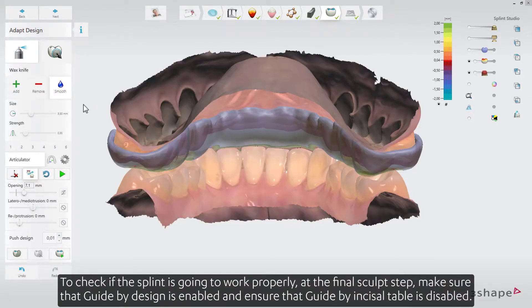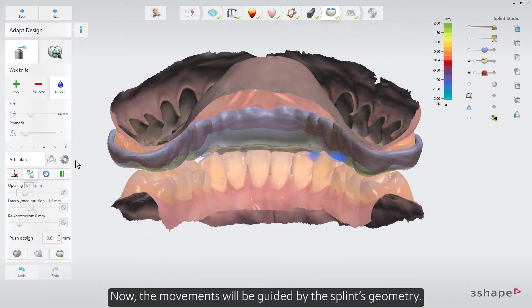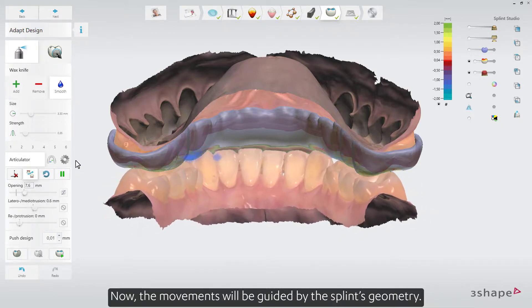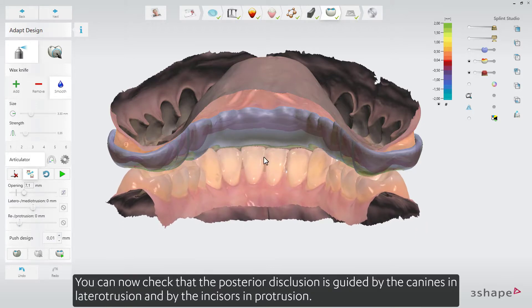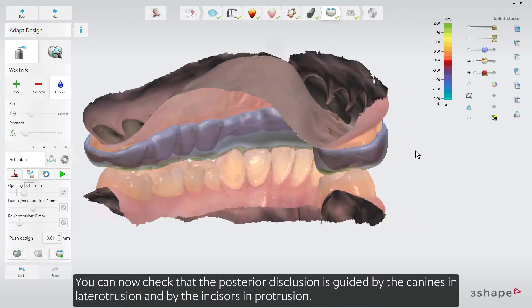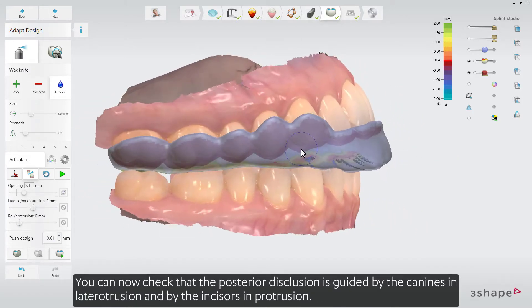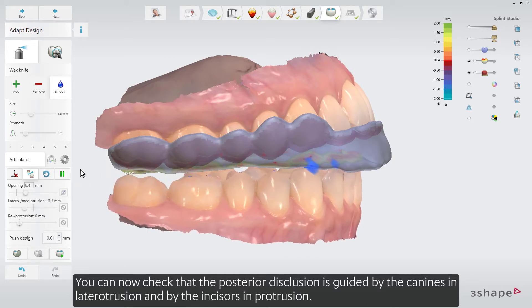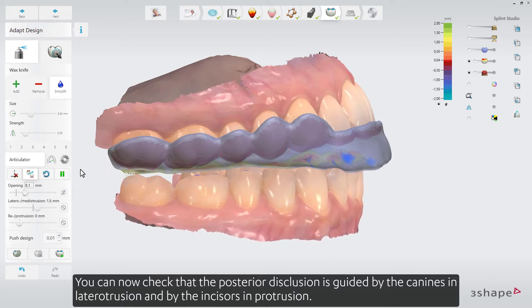To check if the splint is going to work properly, at the final Sculpt step, make sure that Guide by Design is enabled and ensure that Guide by Incisal Table is disabled. Now the movements will be guided by the splint's geometry. You can now check that the posterior disclusion is guided by the canines in laterotrusion and by the incisors in protrusion.